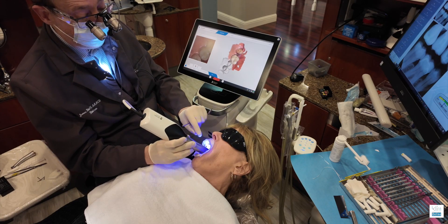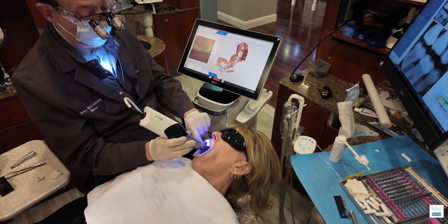ExoCAD is just really working well for me. I still use CEREC every day as well, and I integrate ExoCAD with CEREC.